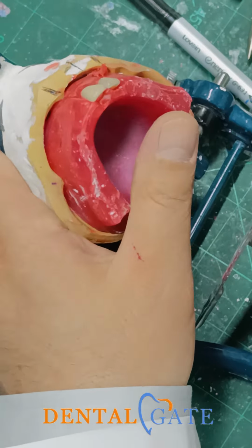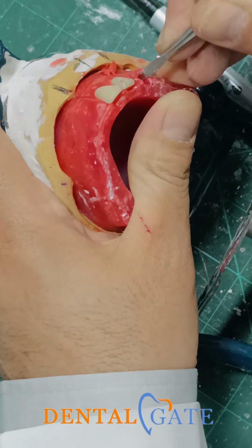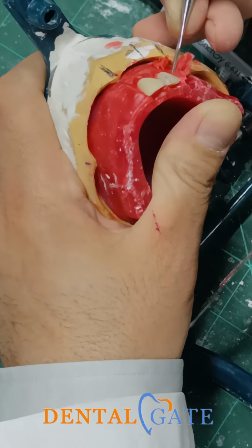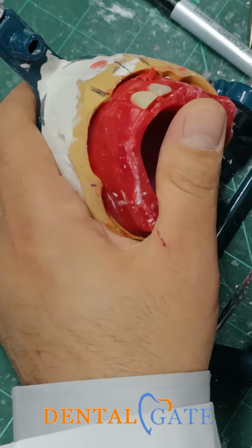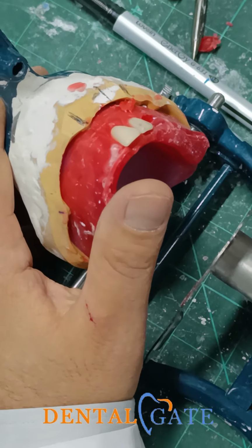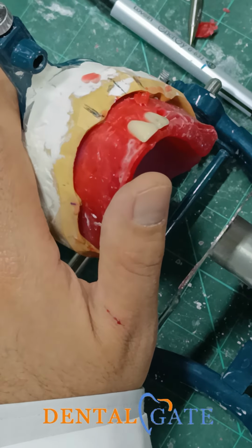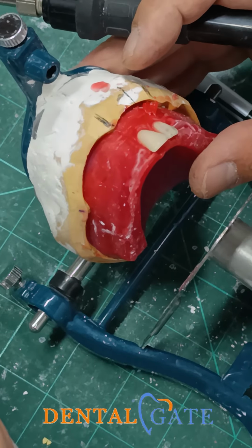Regarding the canine, it needs special care or special criteria. The canine shape provides two sides; it is the cornerstone of the arch. It provides two surfaces.